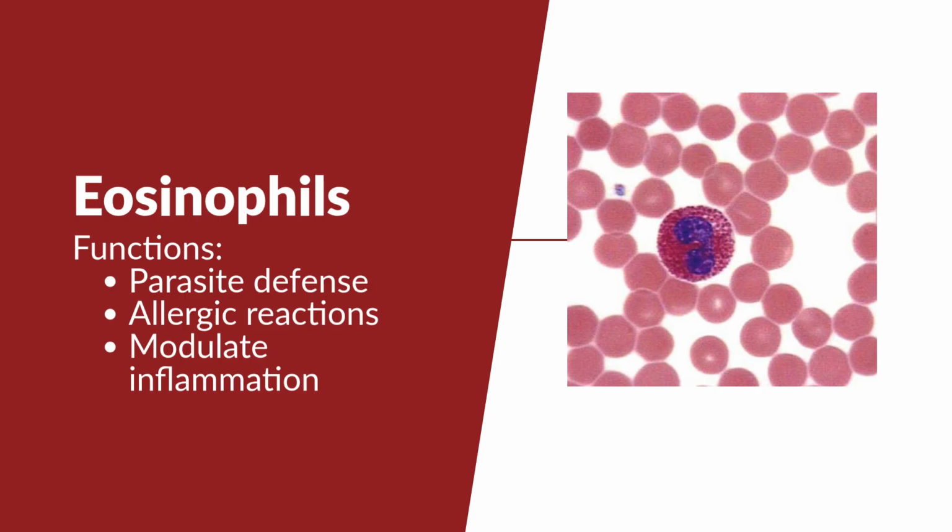Eosinophils look orange and sunburned. That's another memory trick: orange and sunburn. Their bilobed nucleus usually has 2 lobes connected by a thin strand. This helps distinguish eosinophils from neutrophils. Neutrophils usually have 3 to 5 lobes, or 2 to 5 lobes. Eosinophils usually have 2 lobes.